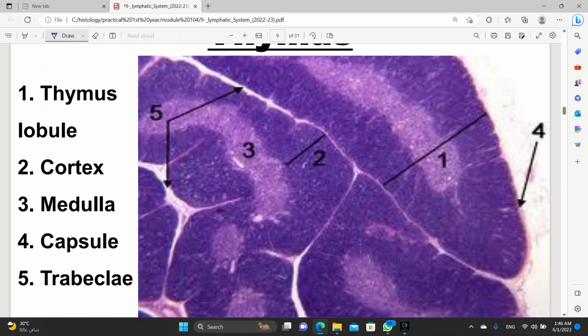And that's the lobule. The lobule, as with anything, if that's the adrenal gland, the inner side is the medulla, the outer is the cortex. Don't think much. That's something that has a gradient. So the inner part is the medulla, outer is the cortex. Inner part is the medulla, outer is cortex. So I think we've covered everything. That's the capsule, of course. We're talking about anything.